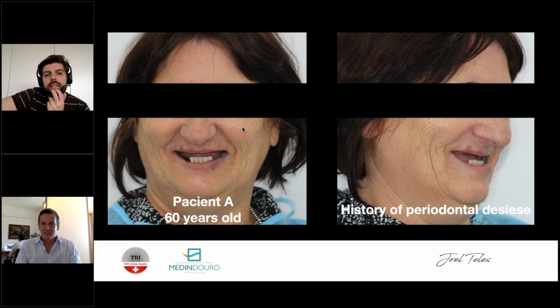Okay, so this lady was 60. She was wearing dentures for several years now, I guess more or less 30, and you can see that it's very resorbed, a very small lip. Lips are always on my mind when I try to plan this, and a very small lip, so there's not much volume to hide anything behind that lip.